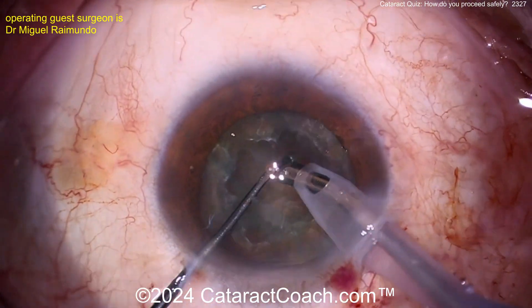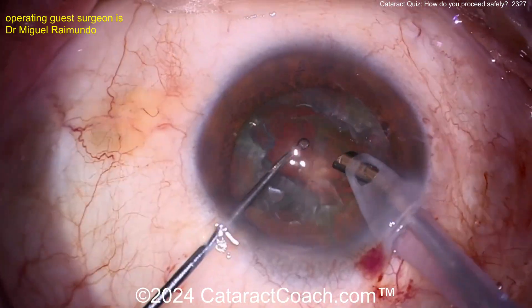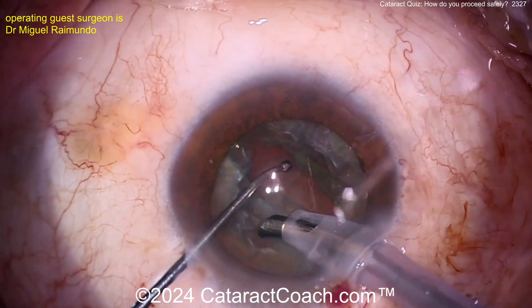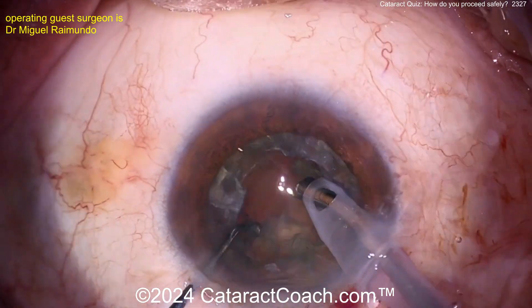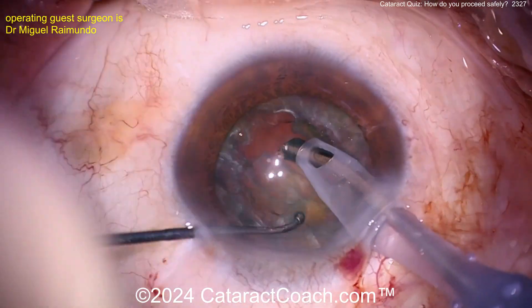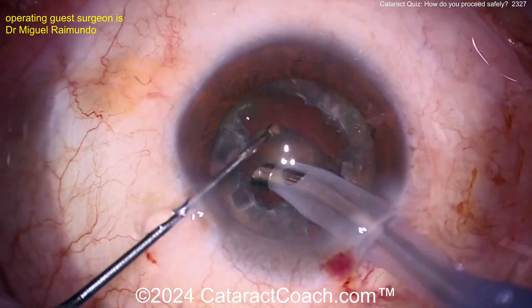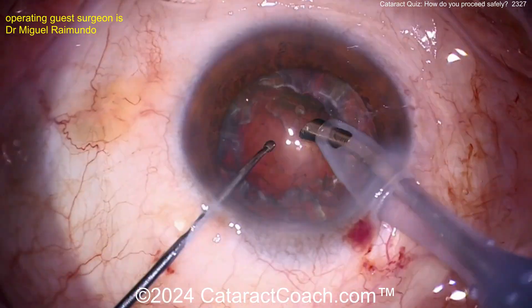I want this nucleus out of the capsule bag — bring it up to the level of the iris, even bring it into the anterior chamber if you want, but I don't want it to fall back into the vitreous cavity. AC is good, VC is bad. AC means anterior chamber, VC means vitreous cavity. You do not want the lens in the vitreous cavity.